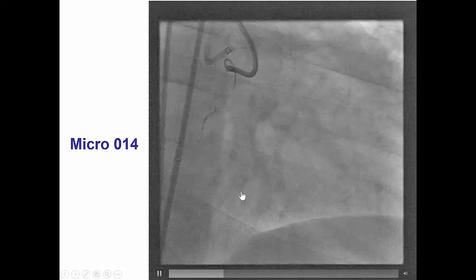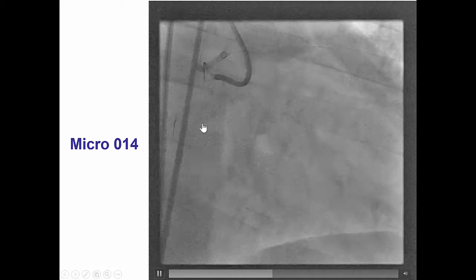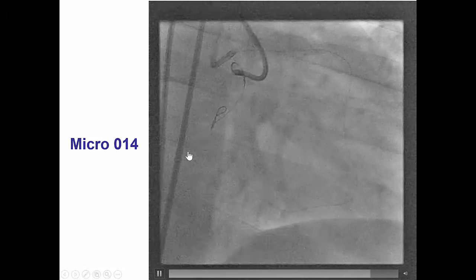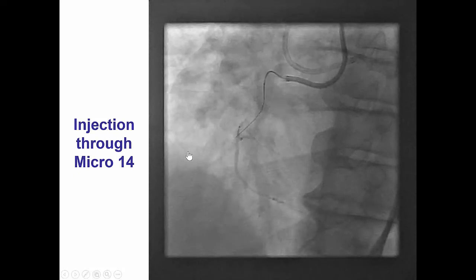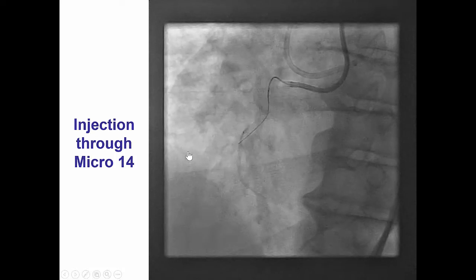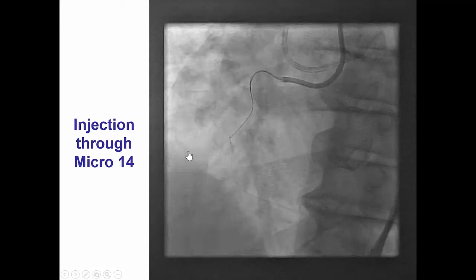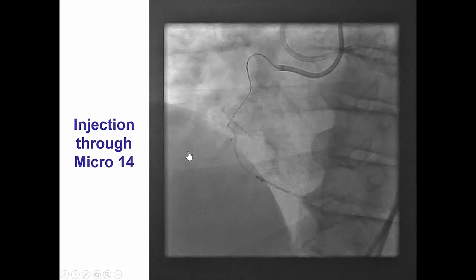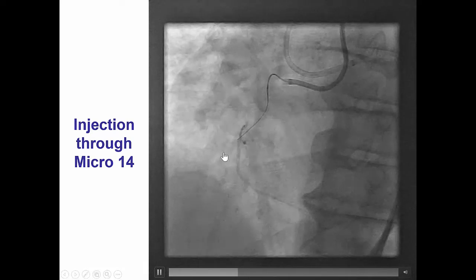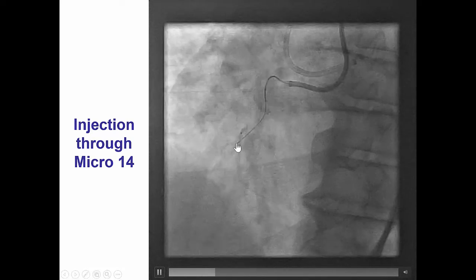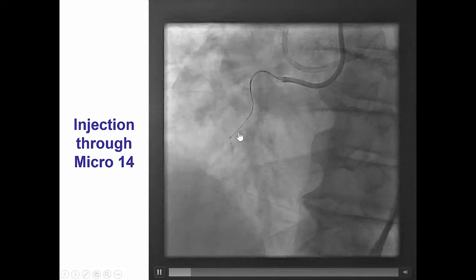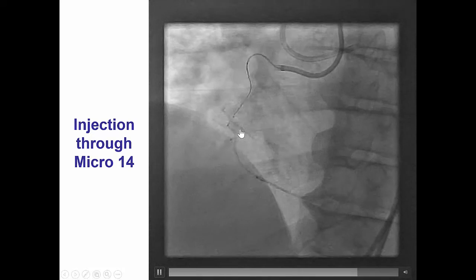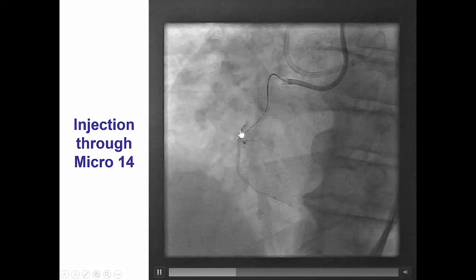We thought it was going to be a distal RCA occlusion; however, we were able to advance the guide wire very easily all the way to the mid-right coronary artery. We often find it very useful to do a retrograde injection of contrast through the retrograde microcatheter in order to understand the anatomy. In this particular case, we are clearly into the mid-right coronary artery, and the antegrade wire is outside the vessel, likely into the pericardium.